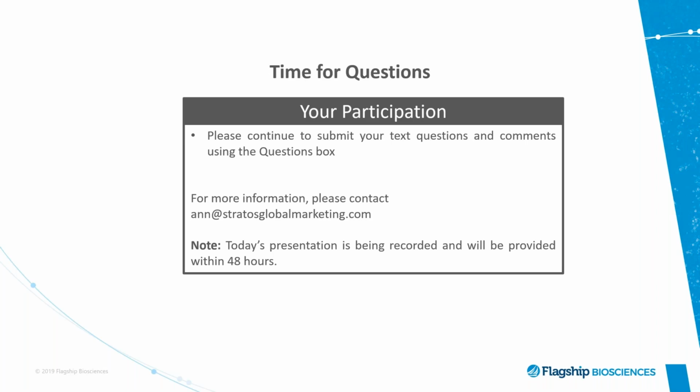Thanks. I think we've already answered this once, but the second question came in again, distinguishing tumor and stroma cells with computer image analysis. You want to bridge that again? Yes, I think this is one of the best features of our system. It's fairly easy using an artificial intelligence approach as guided by the pathologist to identify stroma and tumor. And the reason it's possible to train the algorithm is because the algorithm calculates a number of features, not only of individual cells, but also of the relation of individual cells with neighboring structures to make that distinction.